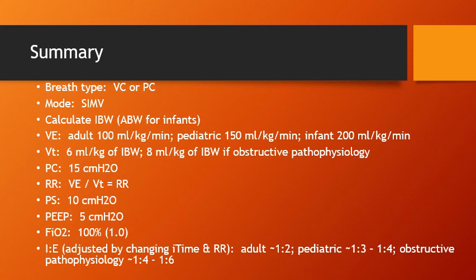Now, all of this information can also be found on the initial ventilator settings reference that you should have printed out, and you will be able to use that for your quiz as well as for the activity that we will start on the next slide.